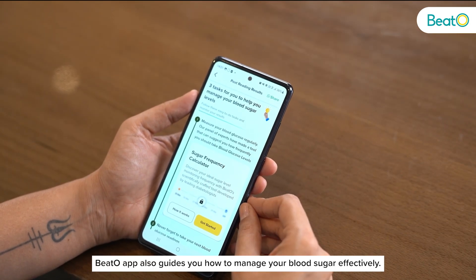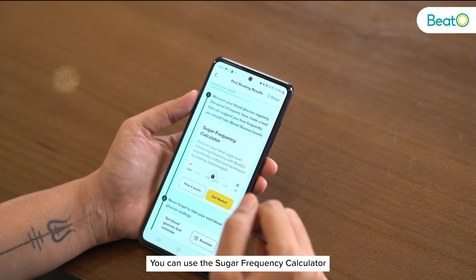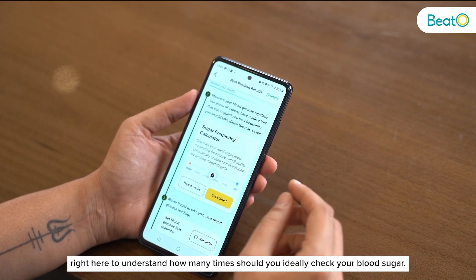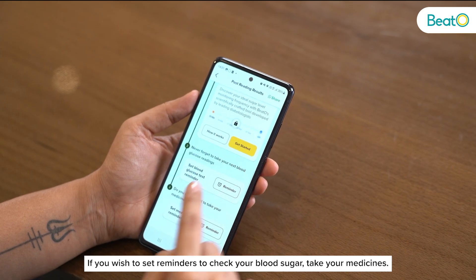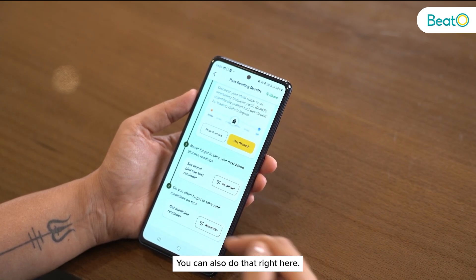The Beto app also guides you on how to manage your blood sugar effectively. You can use the Sugar Frequency Calculator to understand how many times you should ideally check your blood sugar. If you wish to set reminders to check your blood sugar or take your medicines, you can also do that right here.